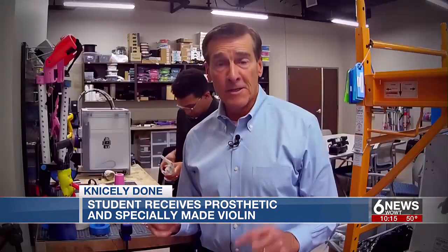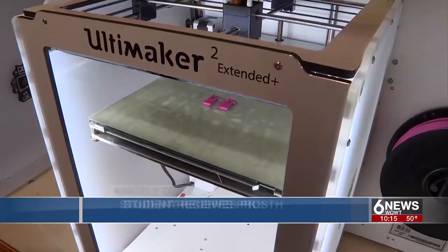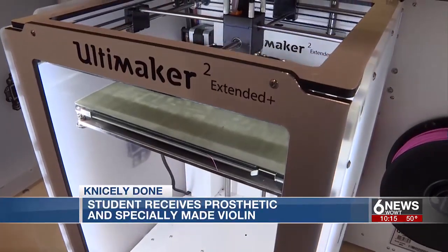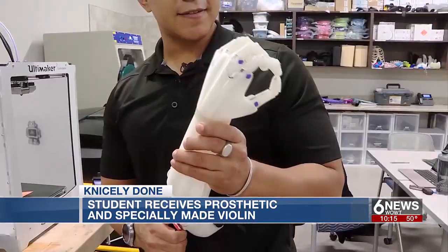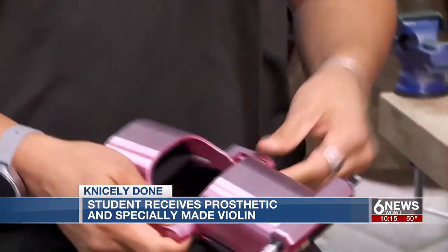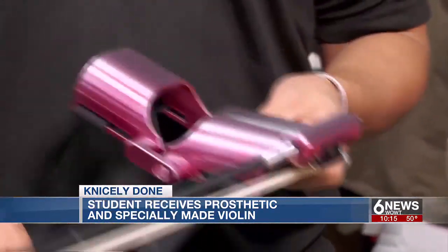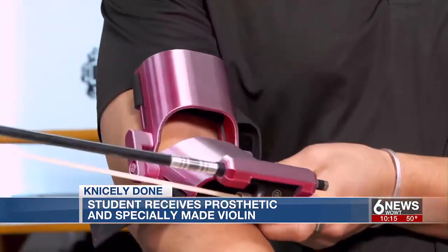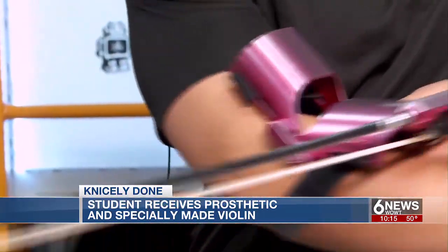What's going on in this lab on the UNO campus is also tied to the violin you just saw — in this case, a very important device. This 3D printer at the Department of Biomechanics has many uses, including making prosthetics. For Cantrell, it's a different design that attaches a prosthetic and bow to his arm. It's going to be placed right over his elbow and allow him to basically hold the bow and then move the bow easily.